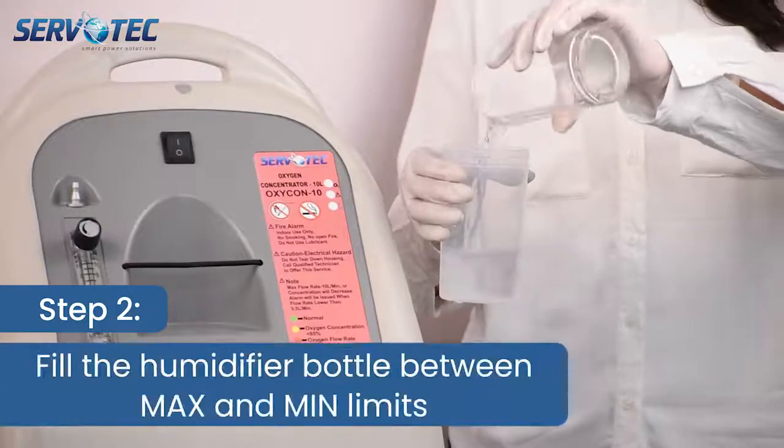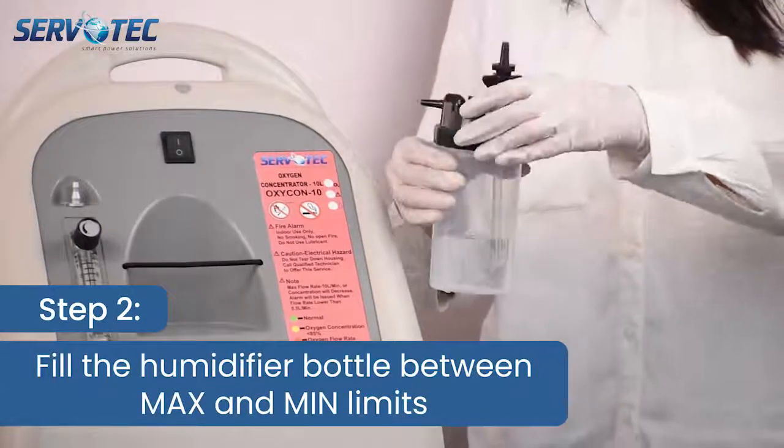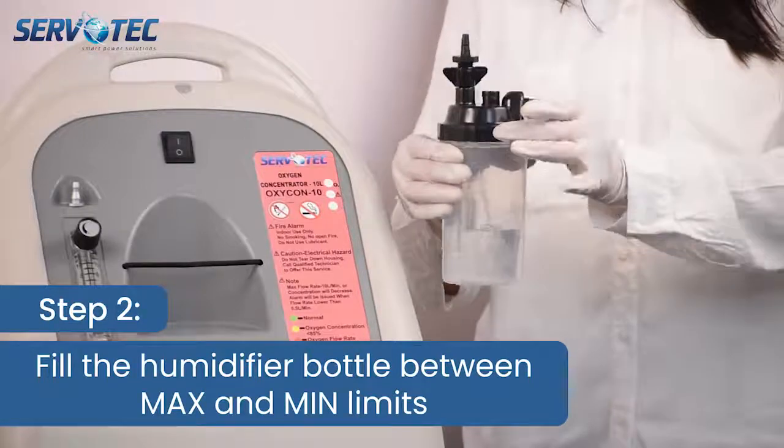Step 2. Fill the water in humidifier bottle and ensure water level remains in between the maximum and minimum mark given on the bottle.